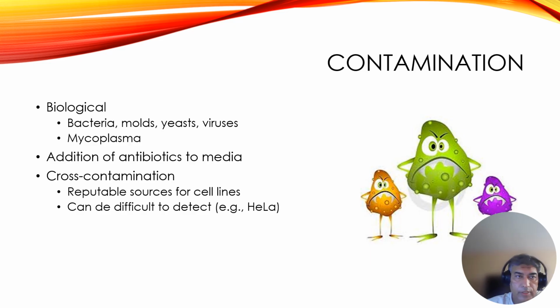Now, what is contamination? Contamination can be biological: bacteria, molds, yeast, viruses, and mycoplasma. To prevent contamination, we add antibiotics to the media, but there are still chances of cross contamination. Use reputable sources for cell lines, as contamination can be difficult to detect, especially for HeLa cells.